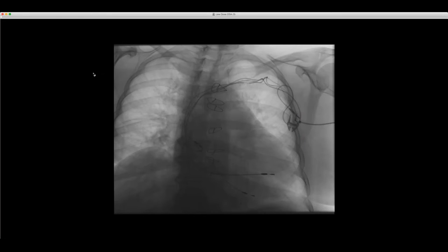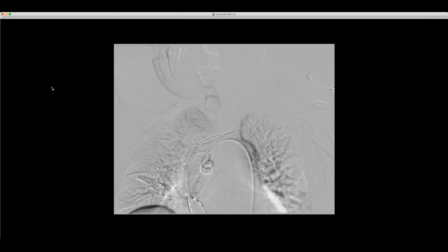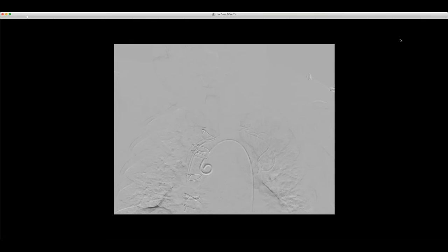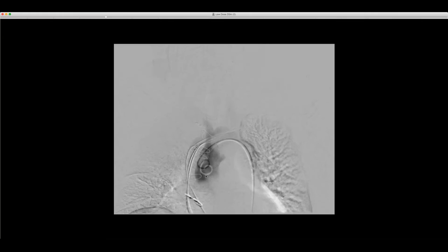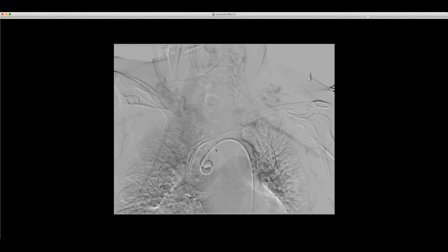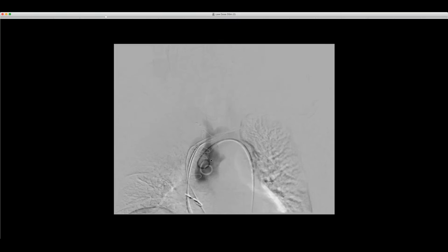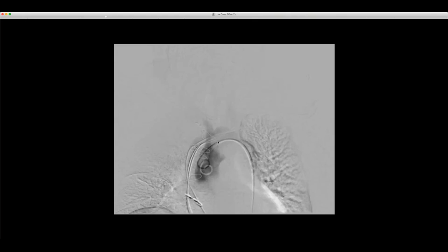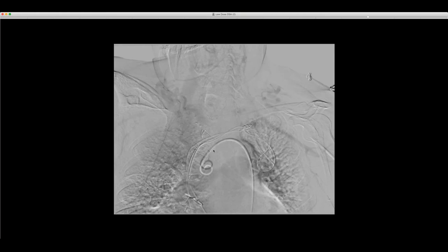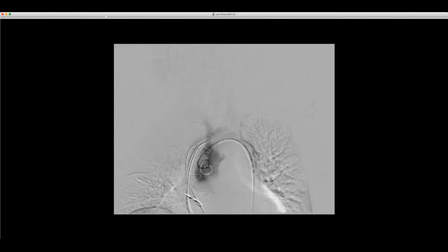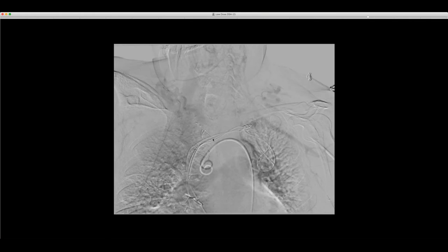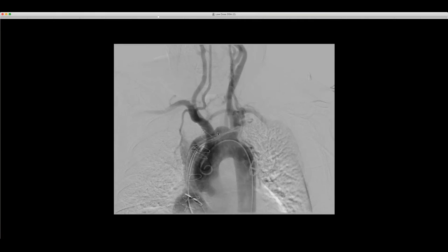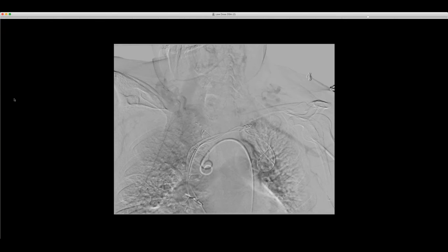I want to show one last case, also courtesy of Dr. Stillman. This is a patient who had some outside studies due to an abnormality seen after pacemaker placement and lead revision. Here's the aortogram — after the aortic injection, you soon see dramatic opacification of the left innominate vein and then all the veins of the thorax. This was concerning for some sort of fistula at some level between the aorta or one of the aortic branches. The earliest thing to opacify is the innominate vein.